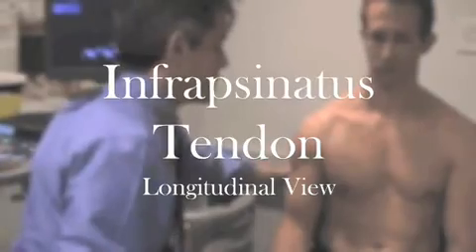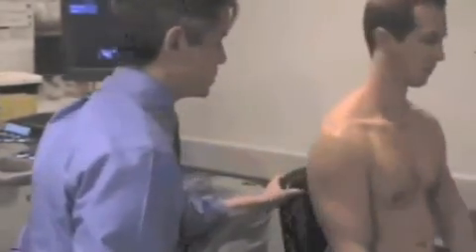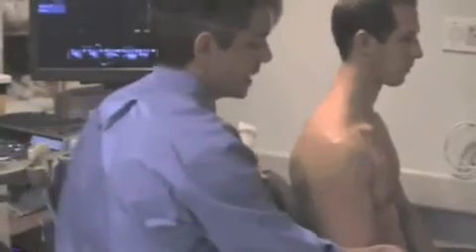To image the infraspinatus tendon in the longitudinal plane, again the patient is rotated slightly on the swivel stool to allow access to the posterior lateral aspect of the shoulder. The patient's arm is positioned across the chest, and the probe is again positioned just slightly posterior and lateral to the shoulder.